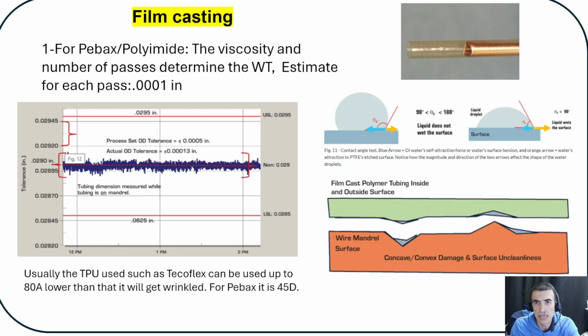And with the resin, there would be very little control over it. Basically, whatever the supplier would give you as a resin lot at that time would be what you have, and you have to see how much the lot to lot variation would be. When you remove all the other noises, then you can see that, okay, now this is the effect of the resin, how much it would be on your tensile, on your yield, on your elongation at break, or other properties.